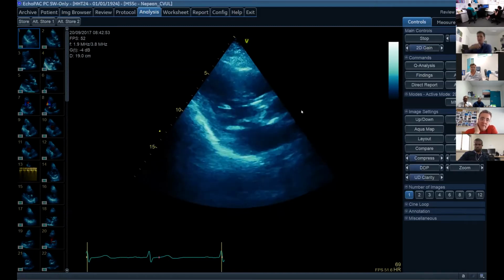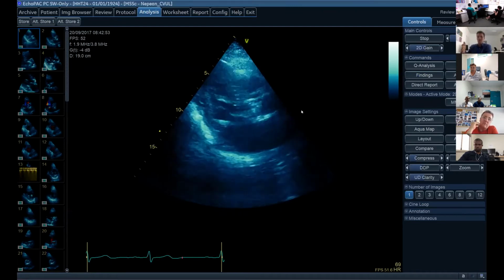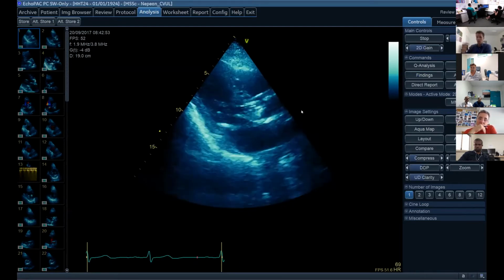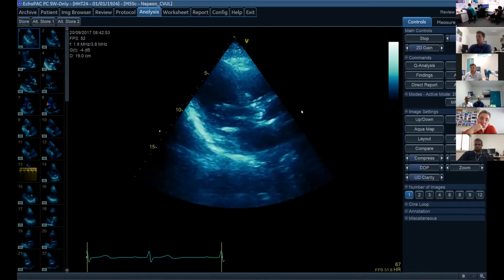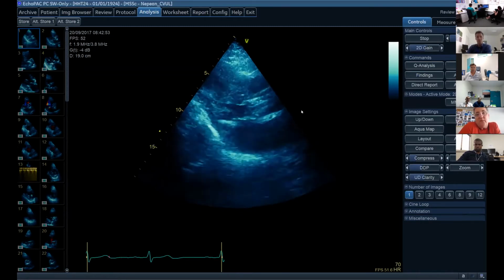We've got a large left atrium. With the hypertrophy and the large left atrium, you've got to be worried about raised left ventricular end diastolic pressure and a chronic component to this process. I'm concerned about that aortic valve and the patient being potentially underfilled as contributing to this. Yeah, and then work your way through.